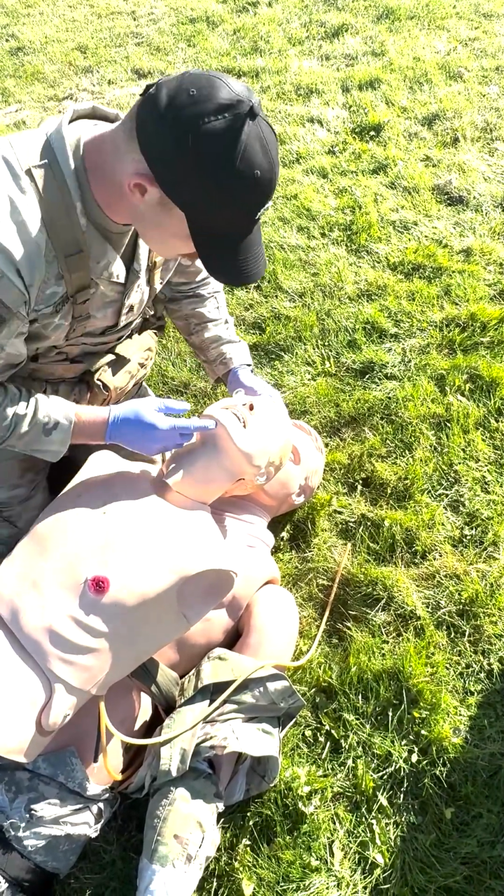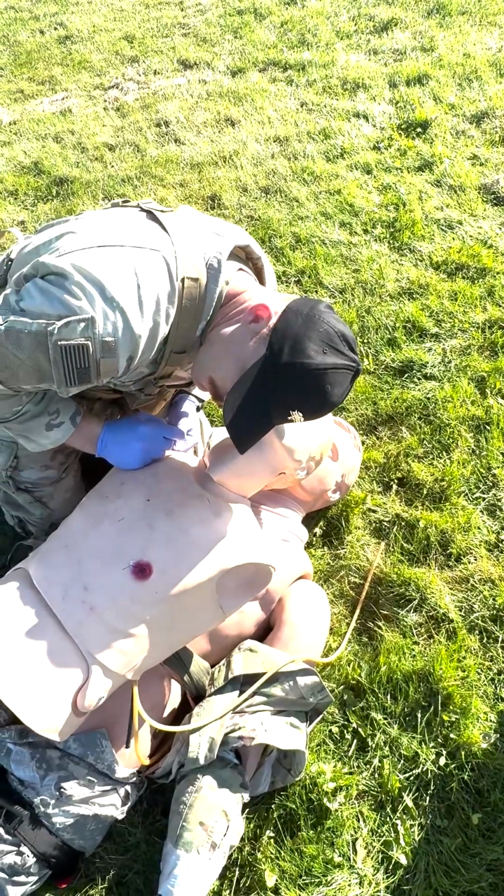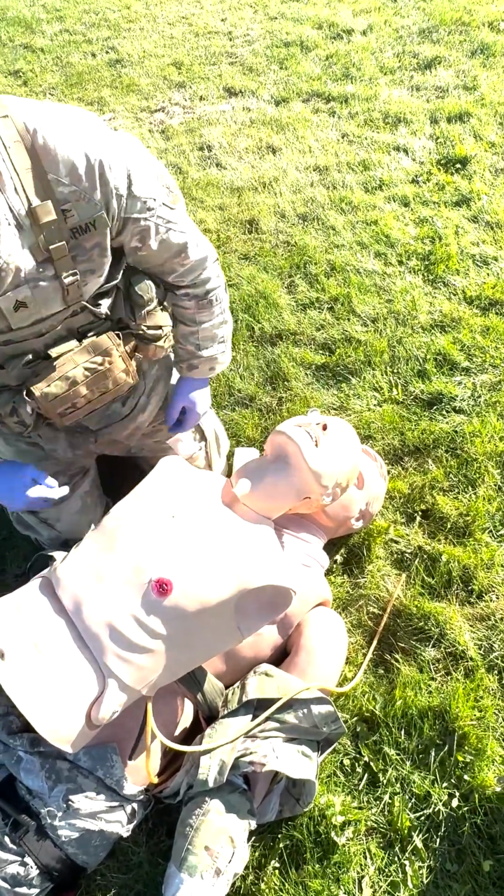MPA is secured. We go ahead, reassess. Airway is patent. This guy's good. Move on to my next casualty. Alright, going on to my next patient.